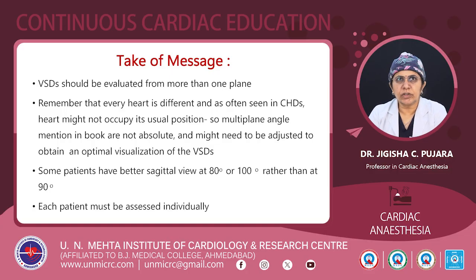Take home message: VSD should be evaluated from more than one plane. Remember that every heart is different, and as often seen in CHDs, the heart might not occupy its usual position. So the multiplane angles mentioned in books are not absolute and might need to be adjusted to obtain optimal visualization of the VSDs.